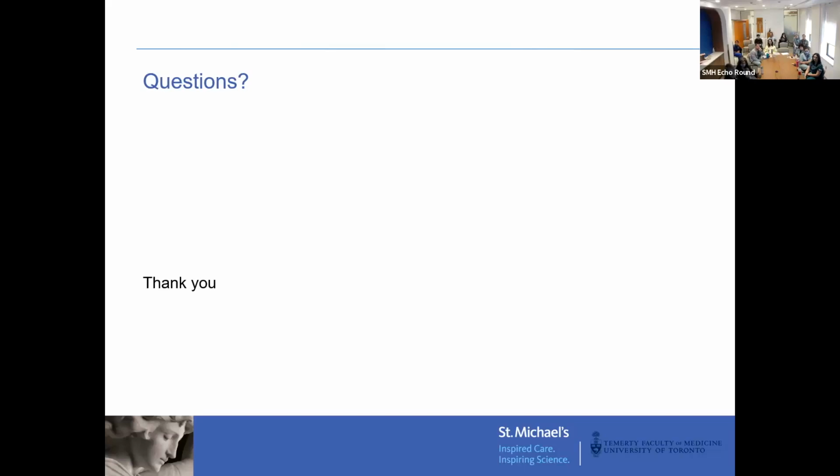What do we do with patients who have a positive GXT but who have a negative echo, a negative stress echo? The ischemic cascade would suggest that they should have wall motion abnormalities before ECG changes. How do we marry the two concepts? And he's helped me out by saying it's a tough question, which it is. Well, I'm happy to take anyone else's opinion on this as well.